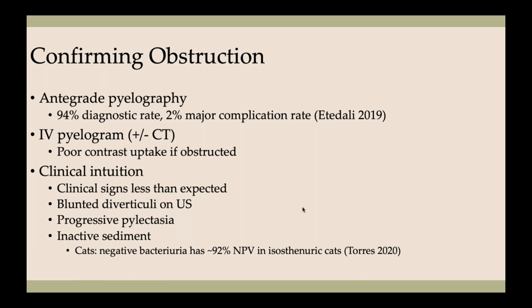So in those cases, if we're really trying to confirm if they are obstructed, you probably have to go with a pyelogram. And we published a retrospective analysis of pyelography showing that it was very safe and very highly useful.